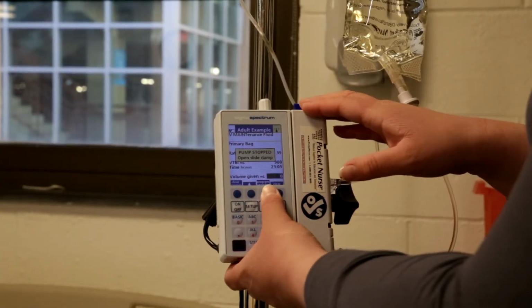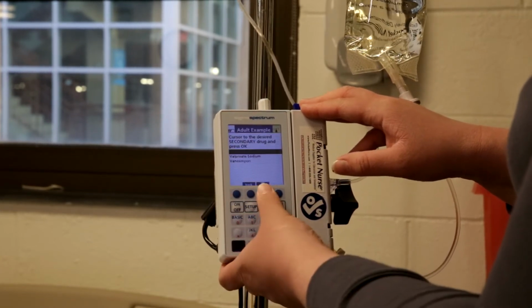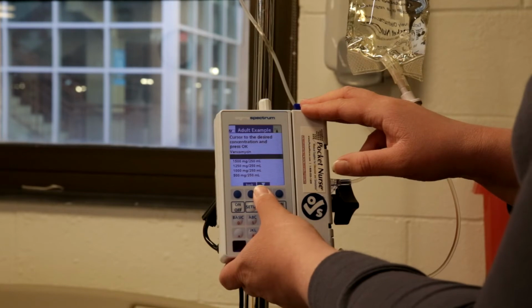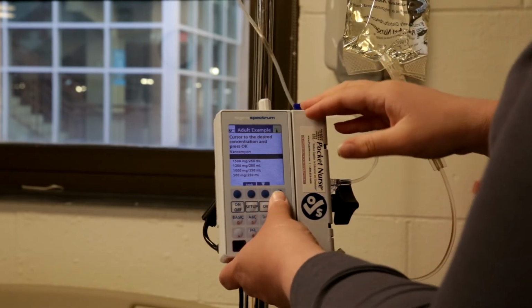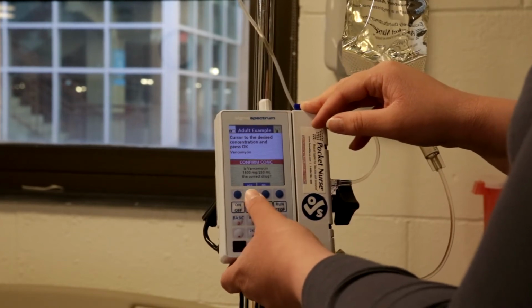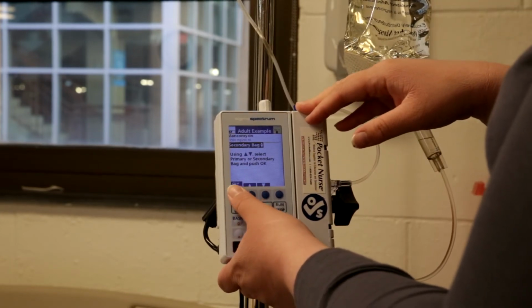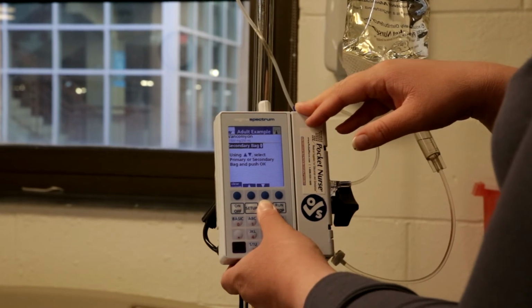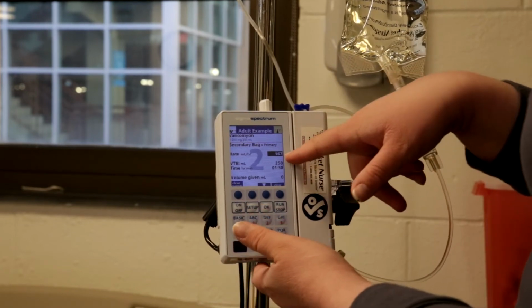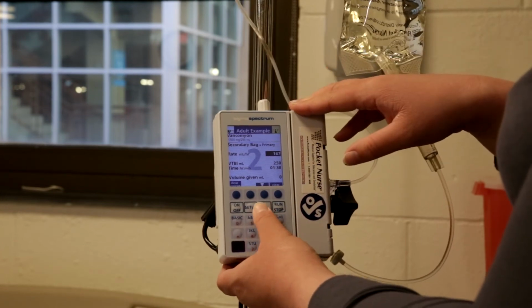Okay, so now I'm going to set up my secondary on here, which is vancomycin. And then we have 1,500 milligrams and 250 mLs. Just going to compare it to the bag, and that's yes. And then going to hit okay. Secondary bag. And then it automatically puts in the rate for us, so 167 mLs per hour is going to be 250 mLs, so we're going to hit start.